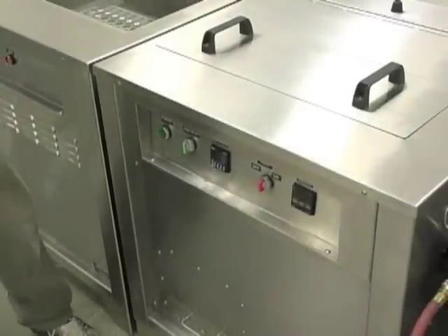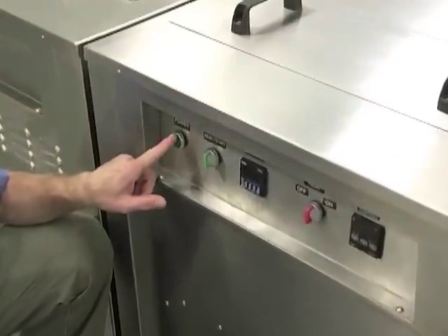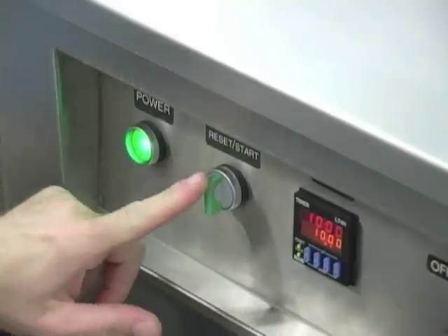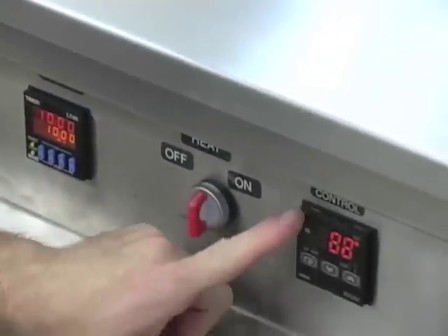Here we have the Natoli Engineering forced air dryer. On the front controls we have the main power — turn it on and the push button illuminates green. We have the timer reset, start, timer, heat on and off, and a temperature control.